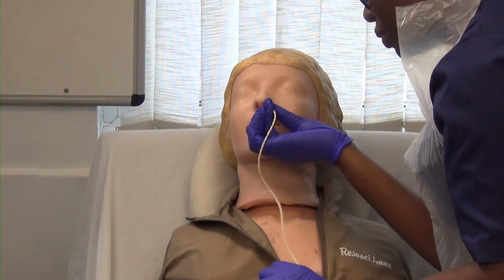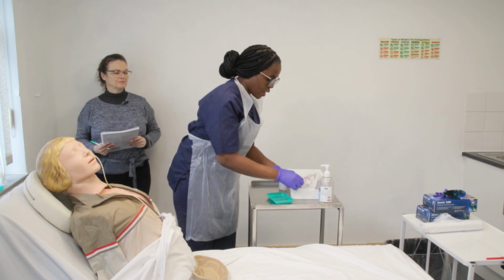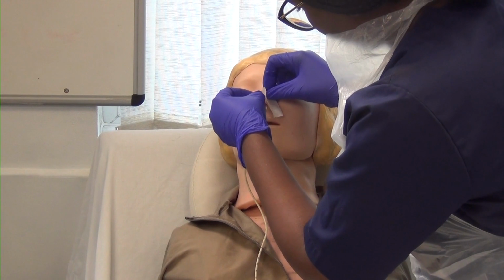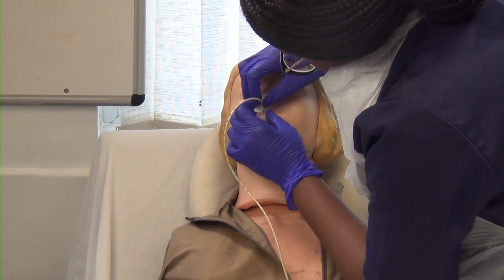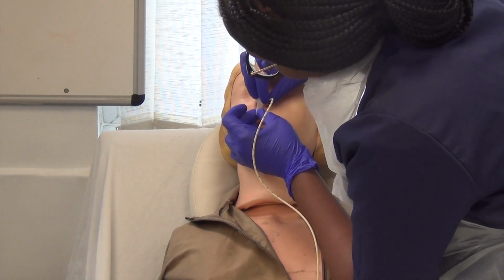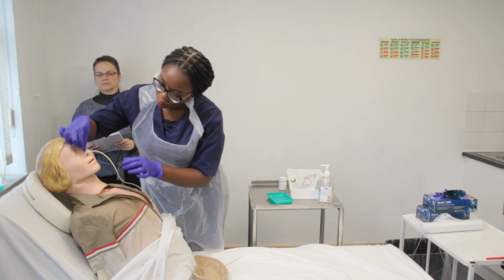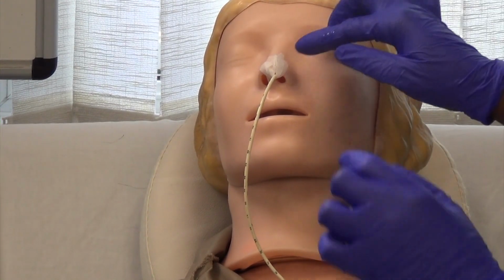All right, and we're there now, okay? So I will just get the tape and put it on the nostril. I have prepared the tape already, so I'm just going to fasten it to the nostril. Okay, so I've just fastened it.